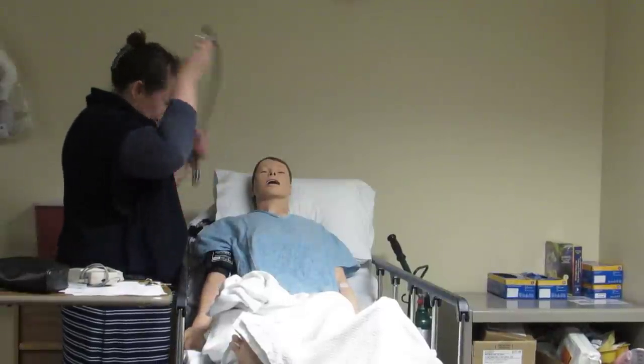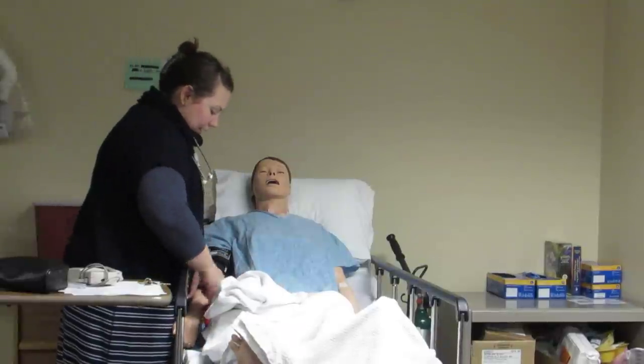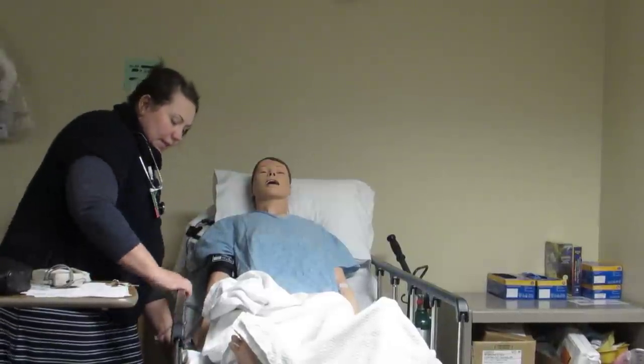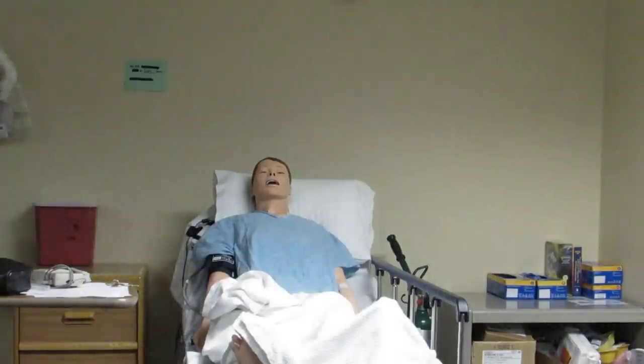Okay, Ms. Smith, your blood pressure is 120 over 80, so that is good. So I'm just going to feel for your heart rate here on your arm. I'm going to put the side rail down just to facilitate it a little bit. I also can put the bed up a little bit to help me.